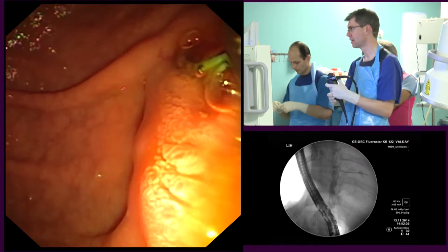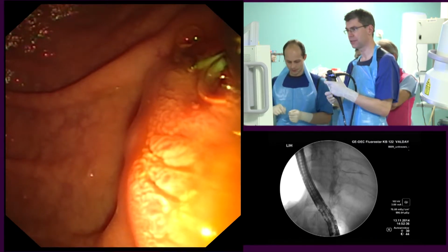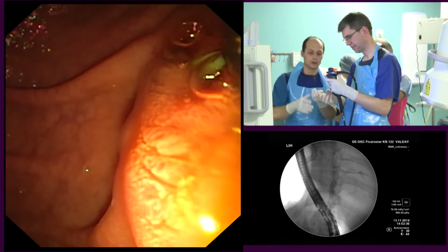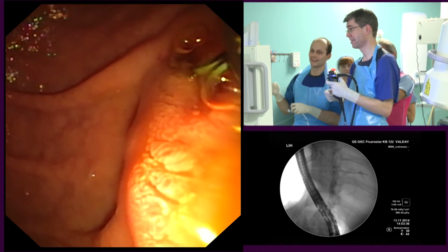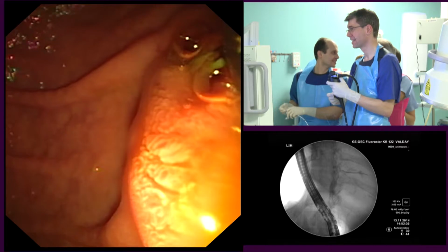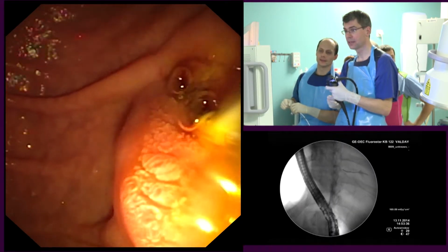Is it the mother-baby scope? No, it's a direct per-oral cholangioscopy, meaning that we exchange. Yeah, we try to exchange. So you try to go inside with the scope. Yeah, this special balloon, when I put it inside. Describe this technique first, with Waxman. So please tell us what to do. Use it to place the transnasal scope. Yes, the same. Here it is. So here's the tiny balloon. You can see two radiopaque markers here, or just one.